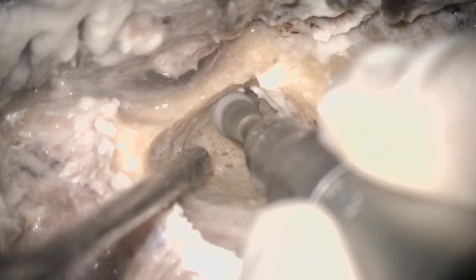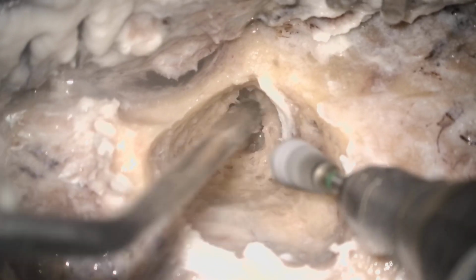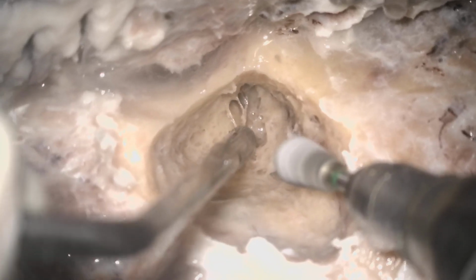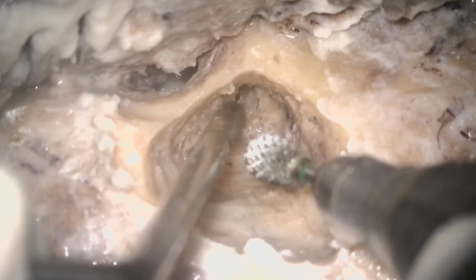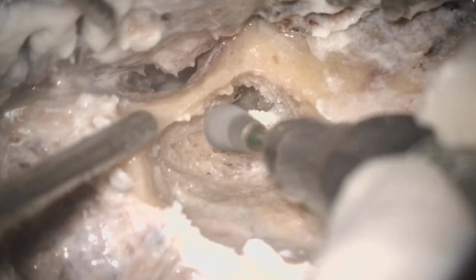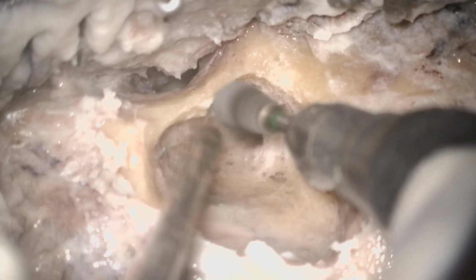This is a very tortuous structure. So this measurement doesn't help every time, because the canal architecture will be different from patient to patient. So always you have to dissect up to the facial recess area, and that will be the actual thickness of the canal.